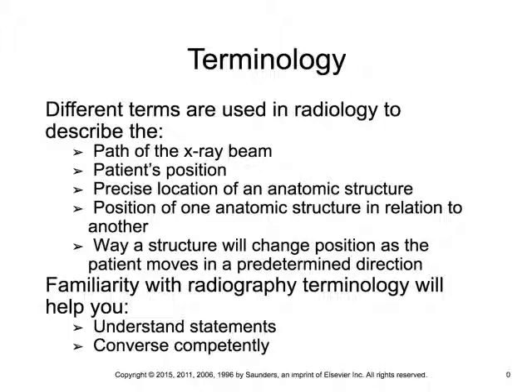We want to be able to visualize a precise anatomic location for the structures that we're looking for. So part of how we do that is we look for bony landmarks. Like last Thursday, we were trying to image the sternum, right? What were some of the bony landmarks that we were using for that? Yep, jugular notch or xiphoid process. We can also call it the manubrium notch, sternal angle. All of those things are going to help us make sure that we're appropriately visualizing the anatomic structure, that we're kind of imagining how this stuff is laid out.